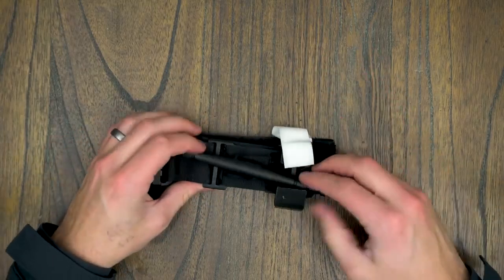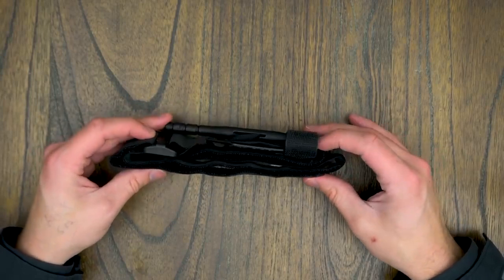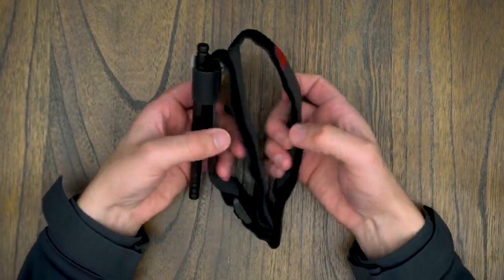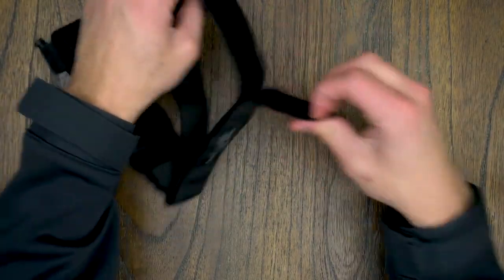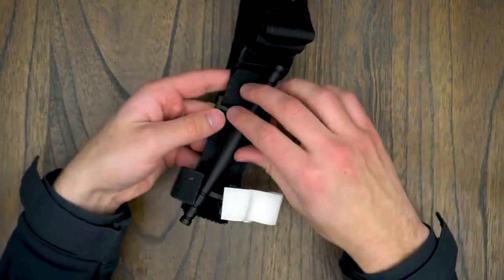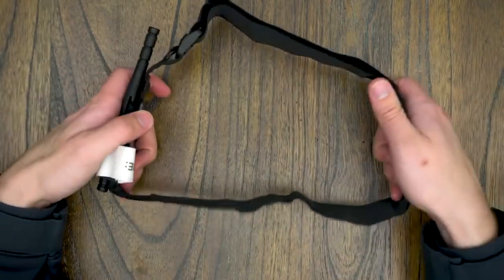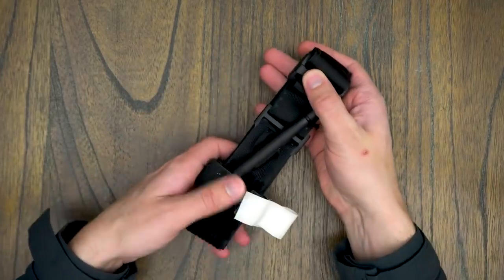I'm going to take the windlass, put it in the bracket, and make sure the time strip's pulled back. So then you have a nice little package here, and when you're ready to deploy it, it can come right off. You can pull this red tab and tighten it around an extremity really fast, and then tighten the windlass. So this is the classic way to fold a tourniquet, and probably the most common, I'd say.